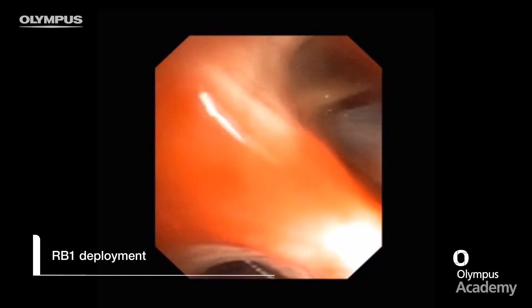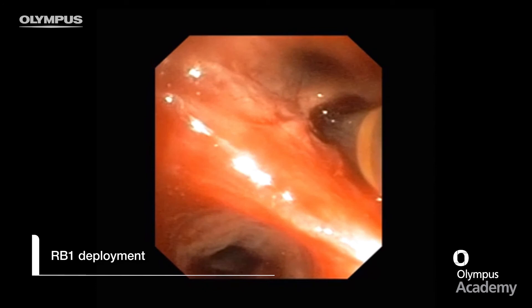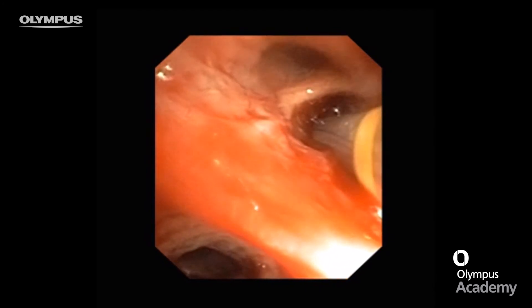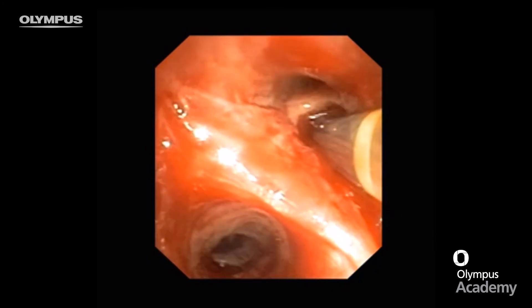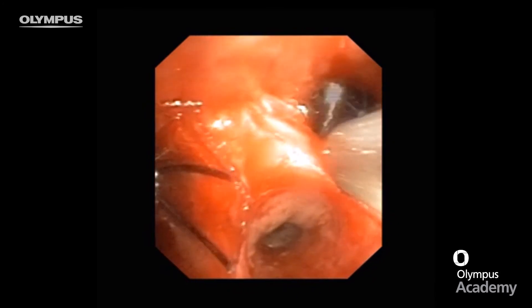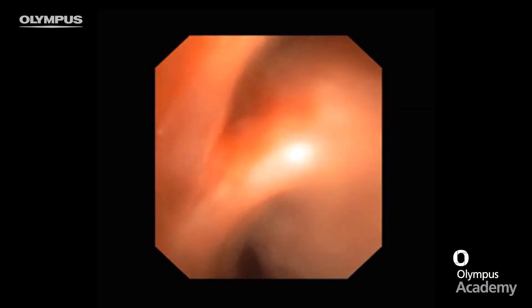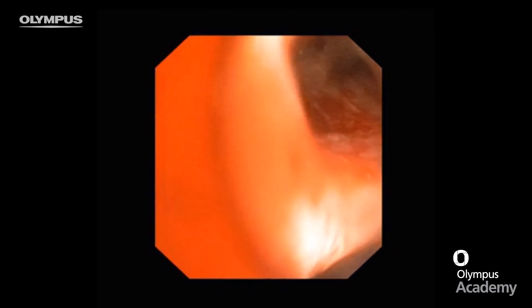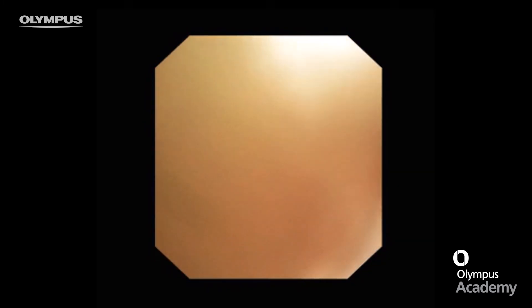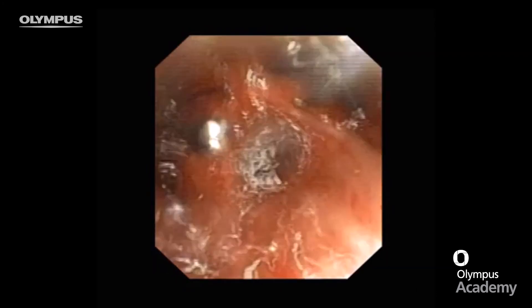I elect to deploy a size 7 valve into RB1. The segment is too short to accommodate the entire length of the catheter tip, so the distal end naturally extends into RB1B. This is perfectly fine — the anchors will end up in that sub-segment, which will not compromise the valve's function or the position of the valve umbrella. One advantage of the spiration valve is that anchors can be deployed into a distal sub-segment, unlike valves that sit on the carina. As a result, a short segment between the opening of the segment and the carina can still achieve appropriate closure with anchors positioned distally.